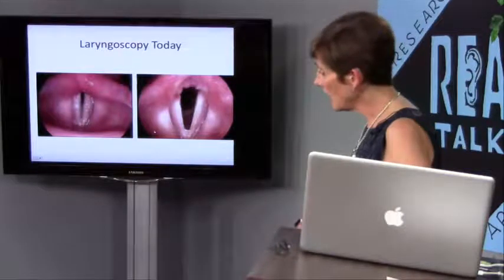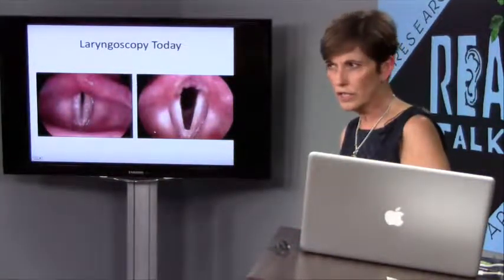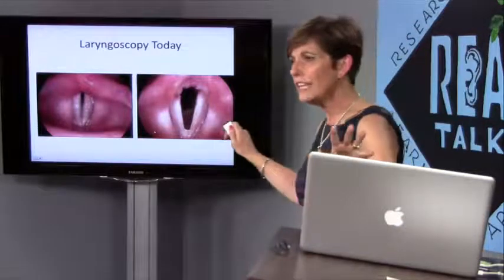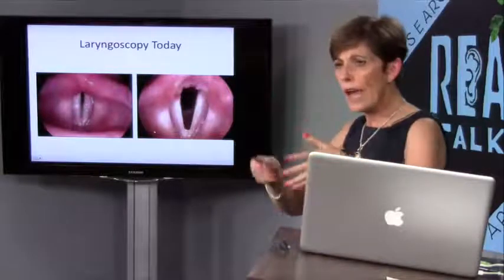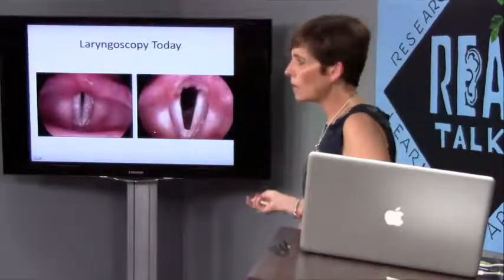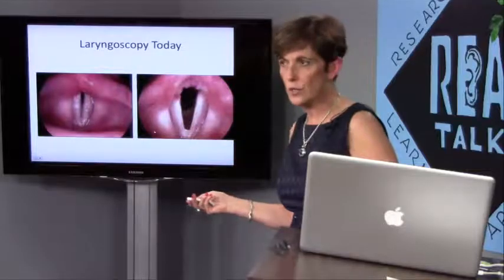But there was a recent study that came out in one of the otolaryngology journals where they polled all the ear, nose, and throat doctors in the United States and asked, when you diagnose a voice problem, do you use video stroboscopy? And only 6.2% of all the physicians in the United States use video stroboscopy. And I will tell you without question, video stroboscopy isn't just the gold standard in diagnosing voice disorders, it is the standard for diagnosing voice disorders.